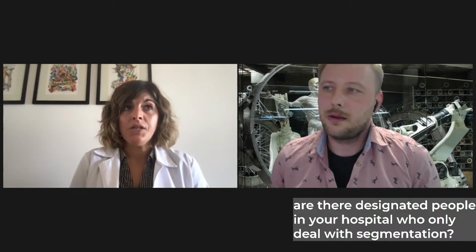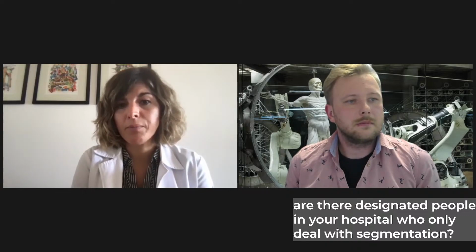Okay, so in my hospital, I work for a children's hospital here, a reference hospital. We have an innovation area with radiologists, which is part of our radiology department. And we are a team. So this is more than ever a multidisciplinary task. You want everybody to take part in this process.